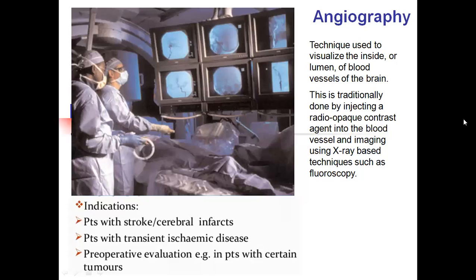Angiography. It's a real-time X-ray study. During this procedure, a catheter placed through the femoral artery is directed up the abdominal aorta into cerebral vessels. Then radiopaque contrast material, or dye in other words, is injected and lights up the blood vessels that are being studied.